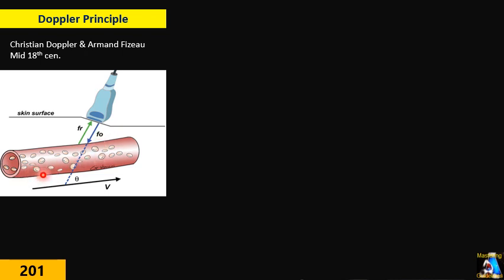toward the moving object, here red blood cells inside of the vessel, if the moving object moves toward the transducer or against the sound wave direction, the frequency that has been reflected by those red blood cells increases. We call this an increasing positive shift, because the Doppler frequency of the reflected sound has increased. And if the moving object goes away from the transducer, or in the same direction as the sound pulse wave, it becomes a negative shift, the frequency dropped.